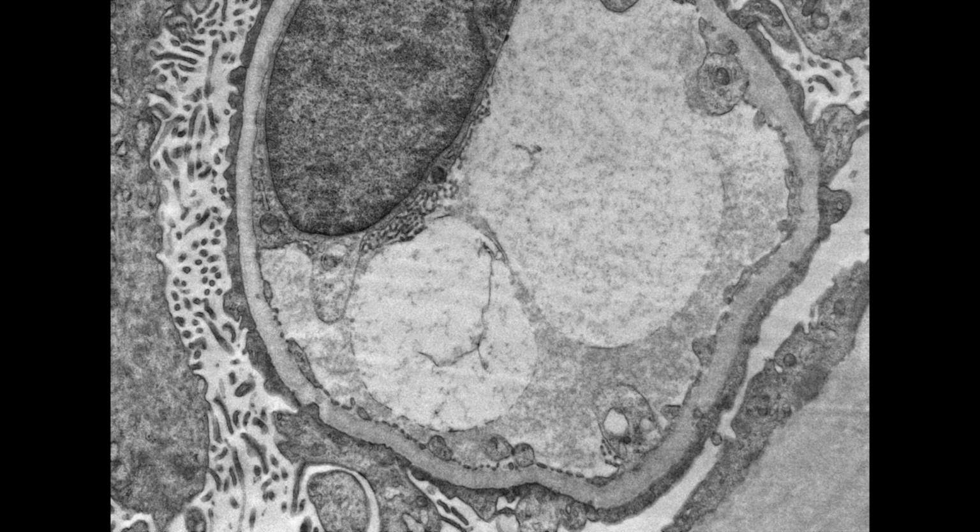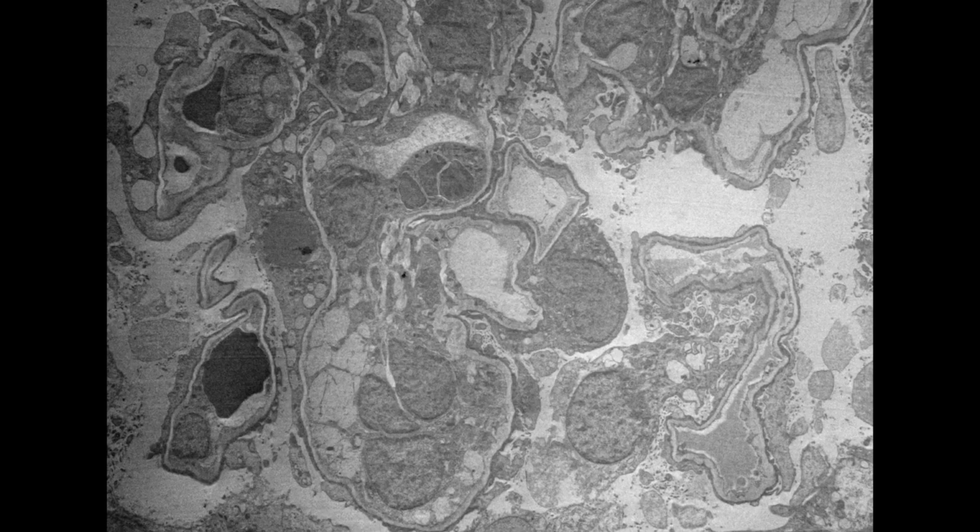So, with these findings, what was your final diagnosis? So with all of these findings put together, we have two diagnoses. From the EM, we have minimal change disease. And from our LRP2 findings, we have an anti-brush border antibody disease, which is an LRP2 associated nephropathy, which goes together with the severe protracted tubular injury, the immunofluorescence staining of the tubular basement membranes and segmental glomerular capillary loops, and the positive LRP2 staining.